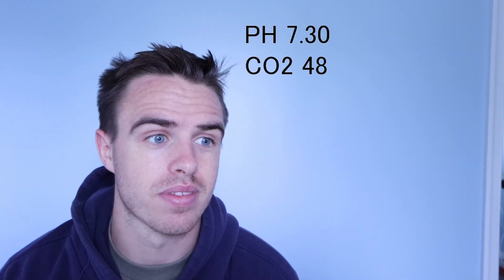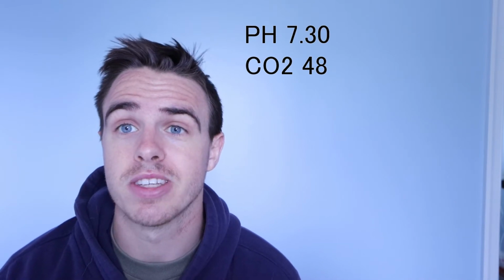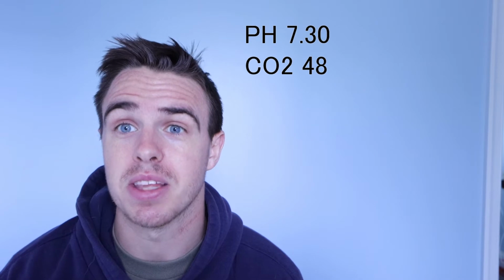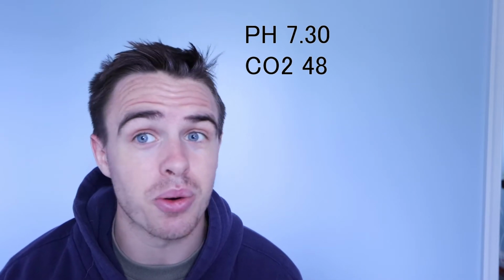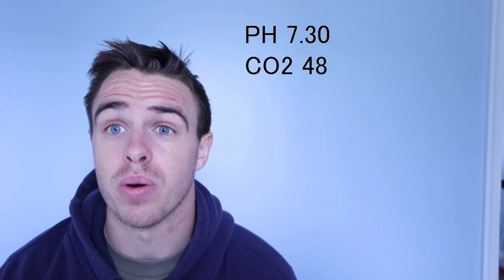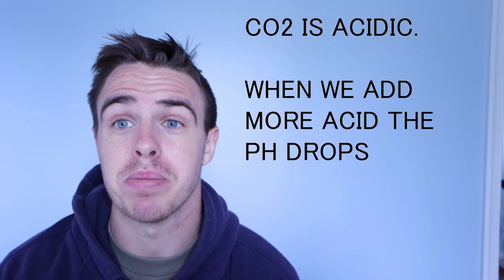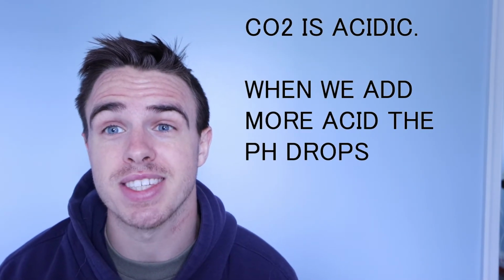So let's look at this one here. This is the same one from earlier. You can see that the pH is not in normal range and the CO2 is not in normal range. Now I just want you to focus on the CO2 here and how it affects the pH. If the CO2 increases, this will make the pH go down because CO2 is acidic.